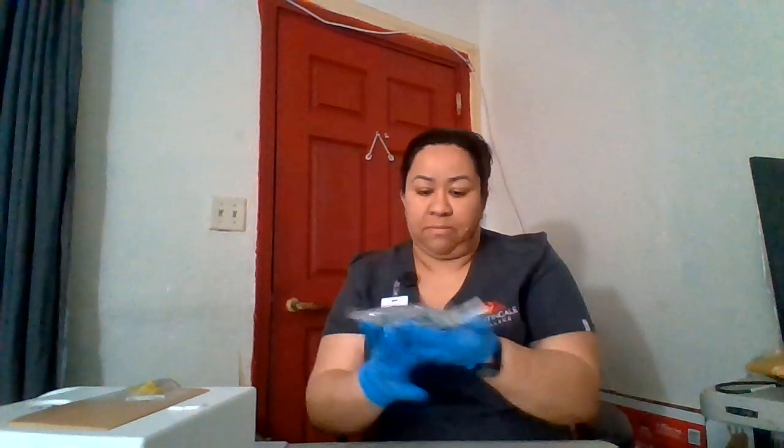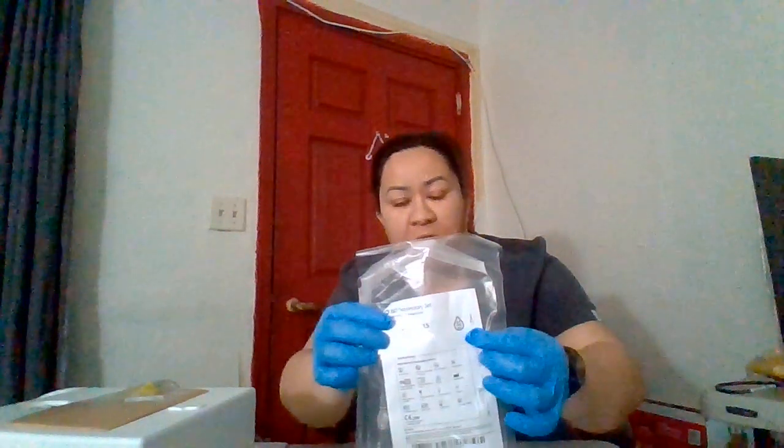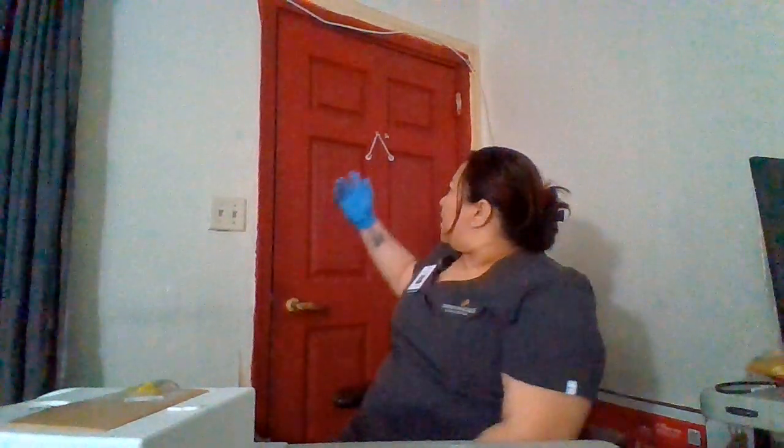So I have gathered the supplies that we need here. We have our primary fluids. We have our macro drip primary tubing. This tubing is 15 drops per ml. Then I also have here our amoxicillin medication. It's in a 100 ml bag. And then I also have our secondary tubing, and this one's also 15 drops per ml. I also have our alcohol prep pads, and I have the piggyback hanger already prepared.